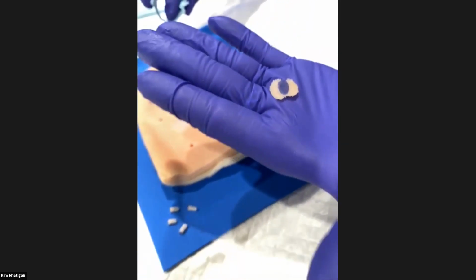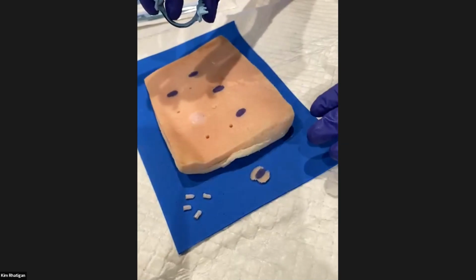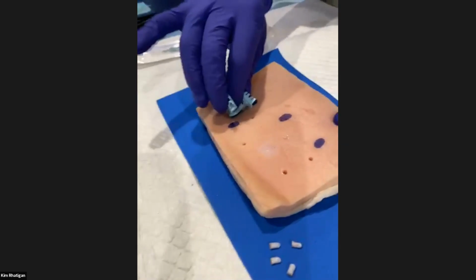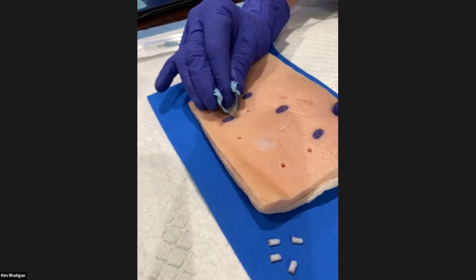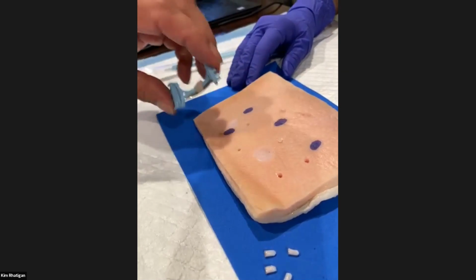Now, the reason you got it so thick is you squeezed your blade together too tightly. What you want to do is just squeeze it a little bit, come in at a high angle and rock back and forth. Then once you're in, you flatten out your blade. Oh, I see. Yep. Scoop it up. The deeper you make that, the bigger the scar.